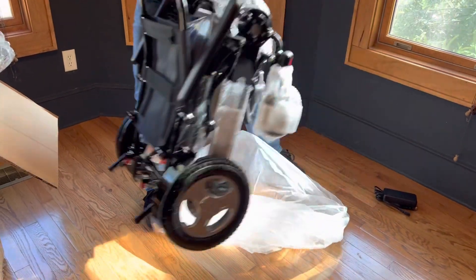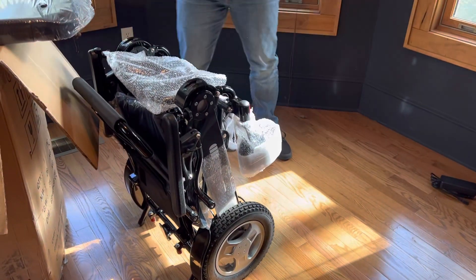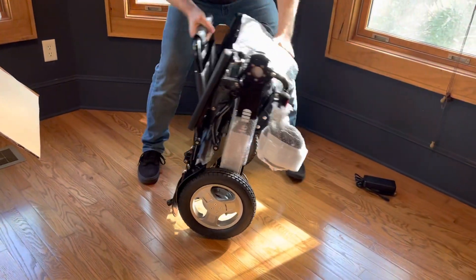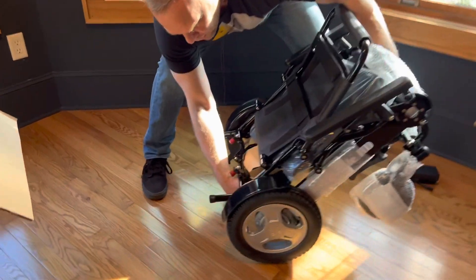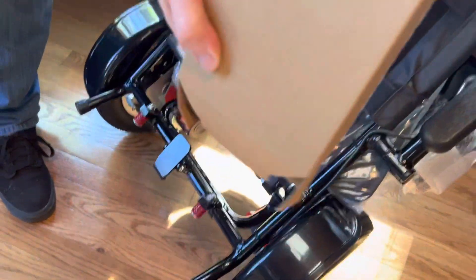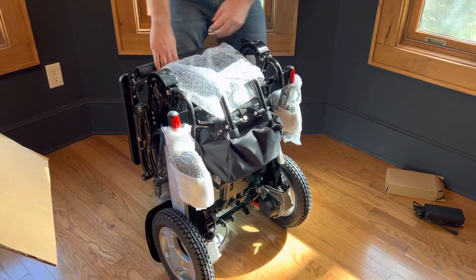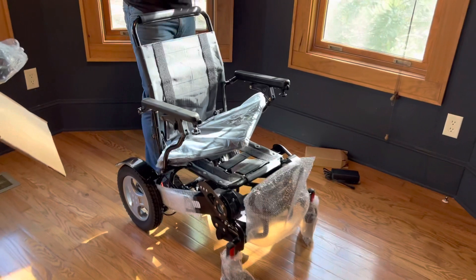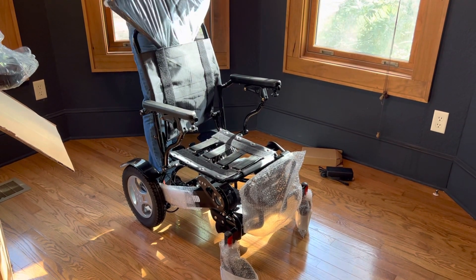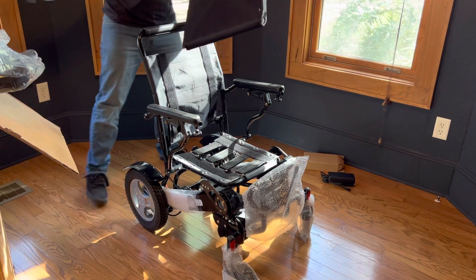I'm just going to lift this out. The Eagle itself only weighs 50 pounds with no batteries and 58 pounds with both batteries. Let's get this chair over here. I can see the wheels are locked, so I'm going to get these two little levers unlocking the wheels. The charger had actually fallen out of this box, so you just have to take a look with unpacking. We open the chair up and now we can see the back cushion — these cushions are packaged well also. Let's go ahead and get the back cushion out.